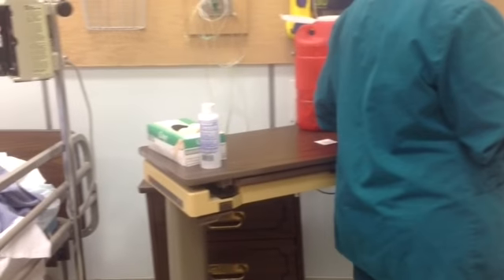So I'm going to quickly double check his information. I'm then going to go over and explain the procedure with him. Make sure that he knows he's getting a shot. I provide privacy beforehand. He has a single room, so I've got to verbalize that part. And then the safety aspect, which I will go over after I verify what we're doing.